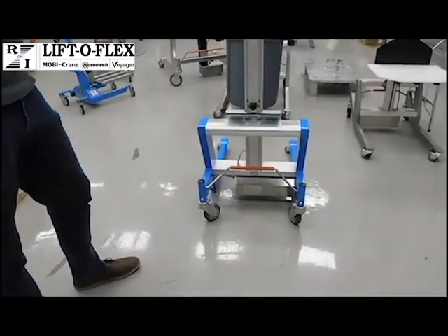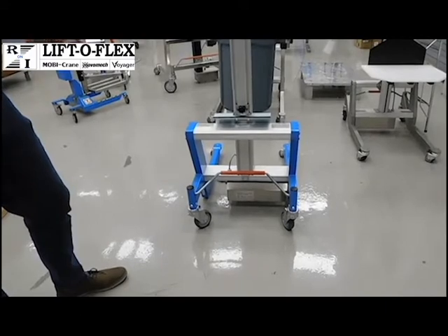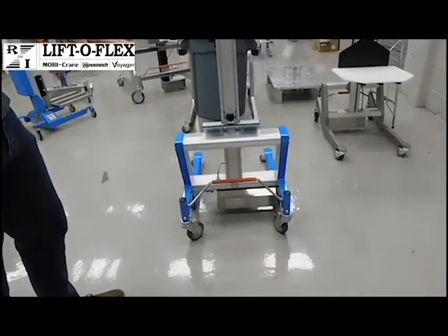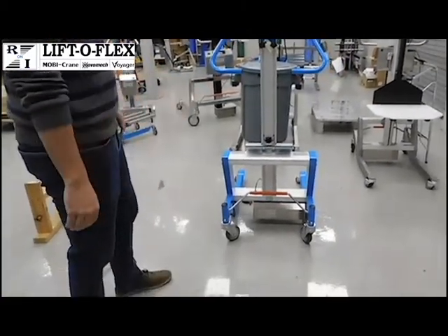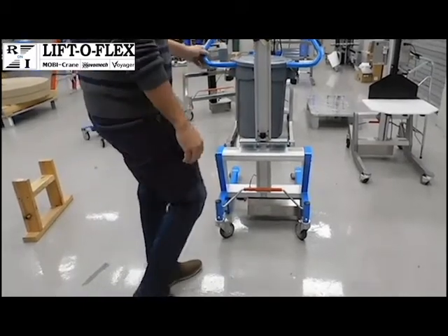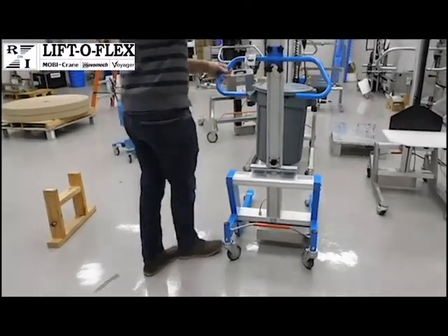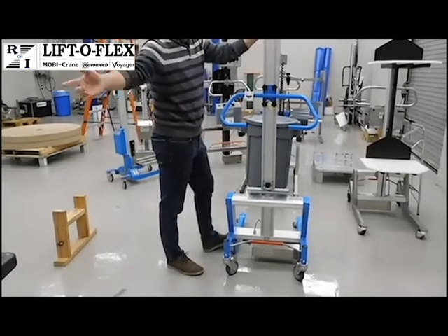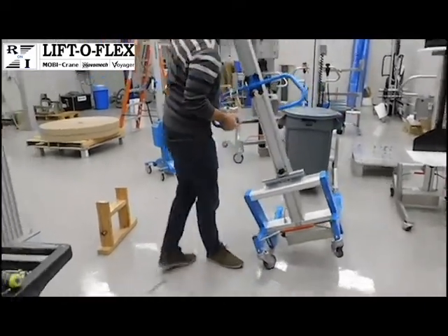These casters are freewheeling, directional lock and brake, so when removing them, it is important to set them in a place so that the next caster can be put on in the same orientation. So what we do is you'll have the lifter, go ahead and brake the wheels. So this puts them in the locked position. And then we've actually removed the power pack, which removes some of the weight from tilting over. You tilt over the lifter.